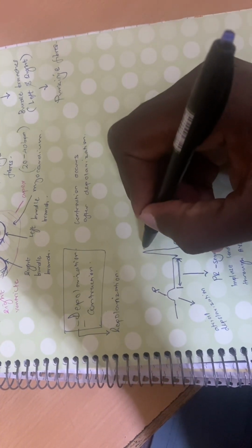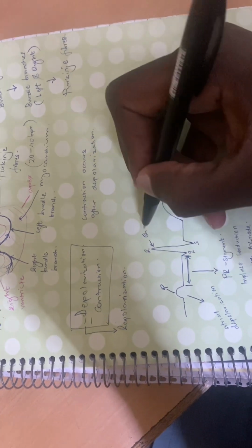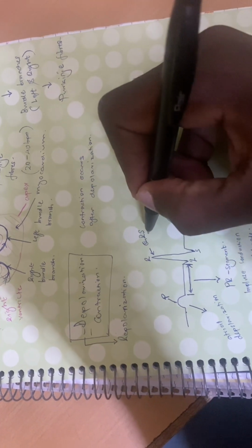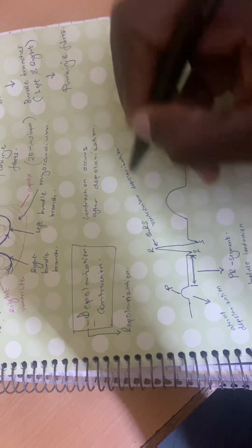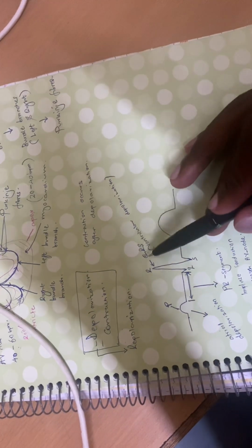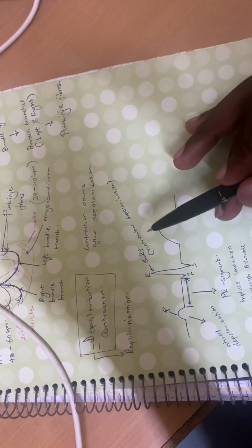Now from there, when impulses move out of AV node, they are going to move so fast to go to the ventricle. So the QRS, this is Q, S, and then this is R. The Q, R, S is for ventricular depolarization. As I say, this is QRS, represents ventricular depolarization. That is both ventricles at the same time.